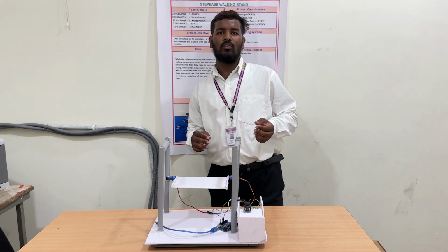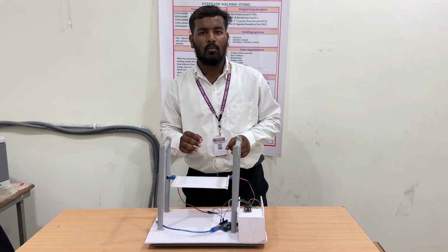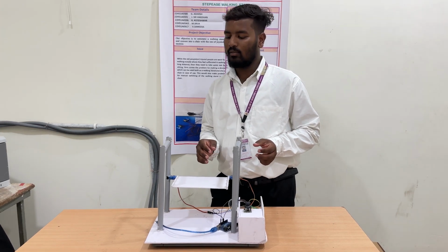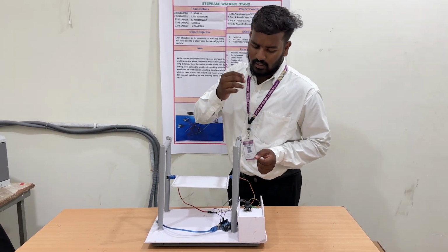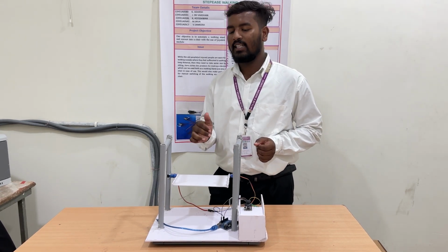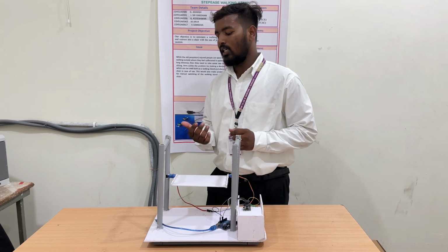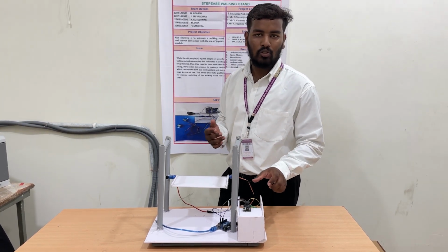The main advantage of this is that a chair and a crutch already exist individually, but here we made it in such a way that both are combined, and it is automated also. Manually we should open the chair with the help of our hands, but here we use the joystick to move the chair up and down. This is the main advantage of this project.